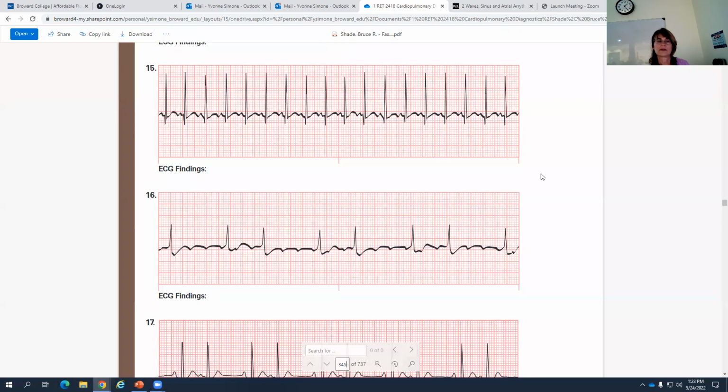What's the difference between atrial fibrillation and atrial flutter? Is that just that there's not as many, looking like artifacts, like how the other one was that we said was atrial fibrillation? She was saying the fib was just kind of a shakiness, but the flutter is actually different flutters, and that's what makes it look different.